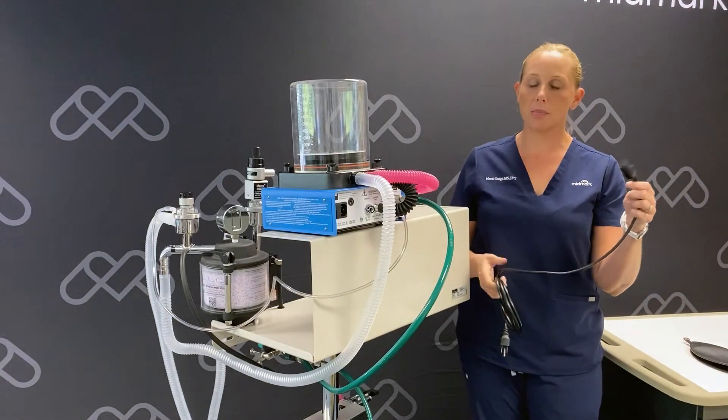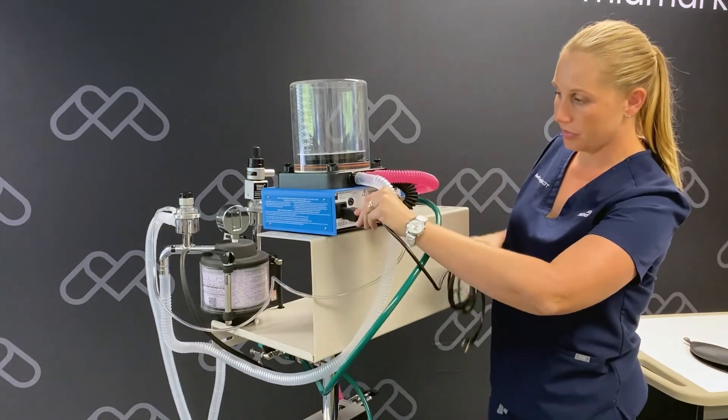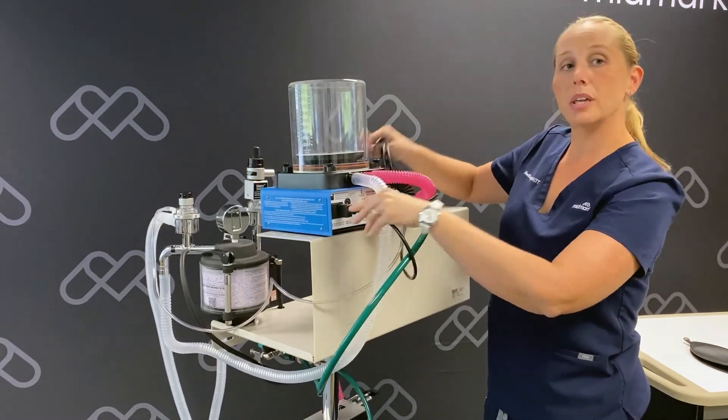Our final step in setup is going to be to connect our power cord to the back of the ventilator, and then we can plug it in.